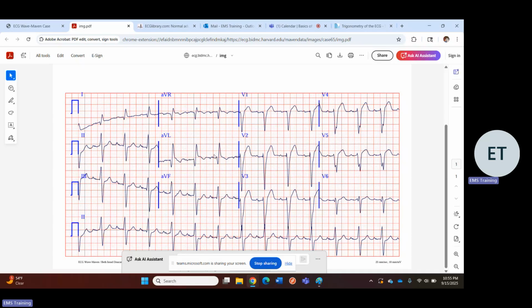There does look like there's biphasic P waves here, which is interesting. So there might be some sort of atrial enlargement or some sort of structural intraventricular conduction delay that's causing the left side of the heart to operate a little bit differently than the right side of the heart, and it's showing up as these notched P waves, and then a wide QRS complex that points down. So it's like a left bundle branch block-esque looking thing. I don't know. Could this be some weird sort of junctional tachycardia? I don't think so, because there's P waves and they look for the most part normal.